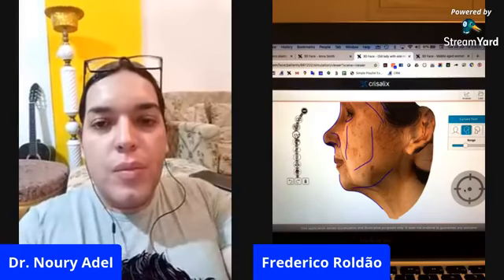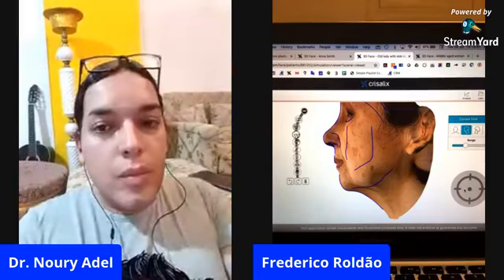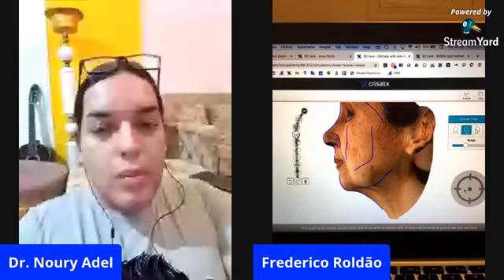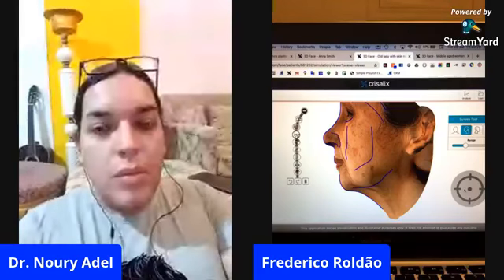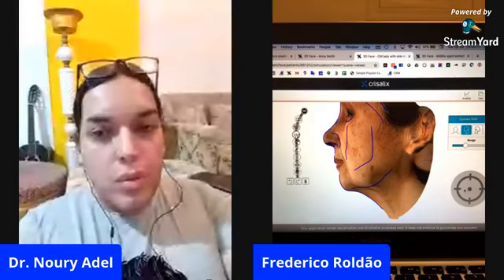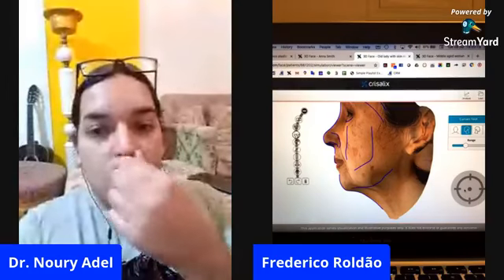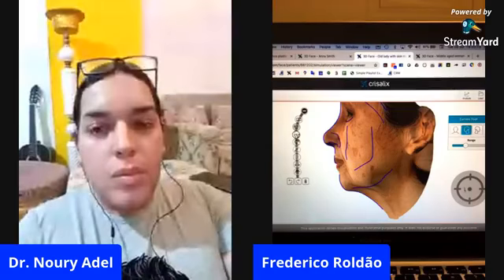Well, we can have an estimation of the volume change on the patient, but you know that one, let's say, 1/10 of a cc would give an effect on you, but would give a different effect on a different patient. So we can't really estimate how much product would have to be used to achieve that effect. That has to be from the doctor's experience.